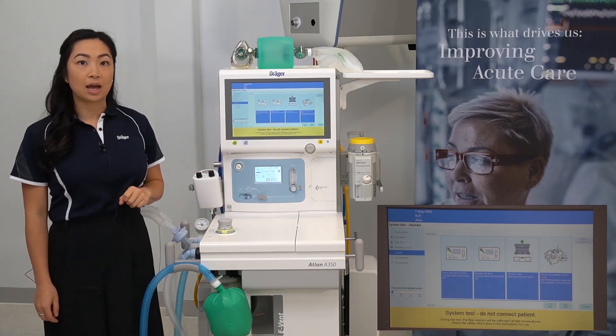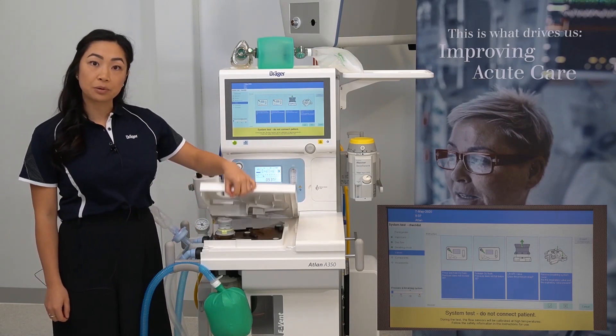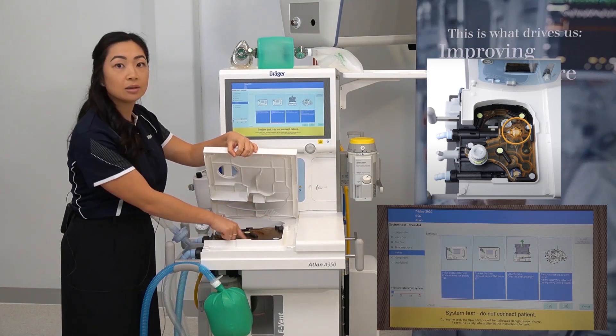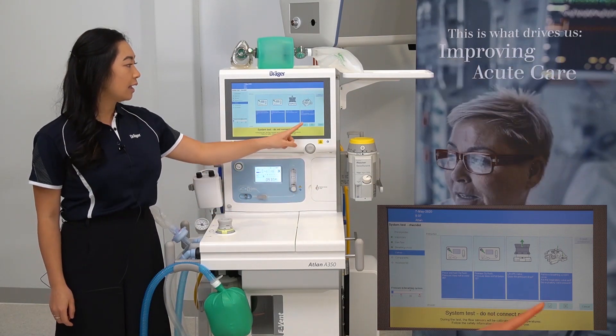Remove the breathing system cover. Can you see the inspiratory and expiratory valves? Lift up the breathing system cover and look for the yellow and the blue inspiratory and expiratory valves. Then press the tick.